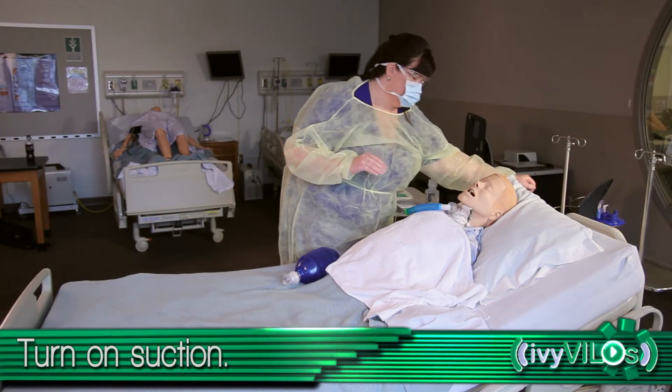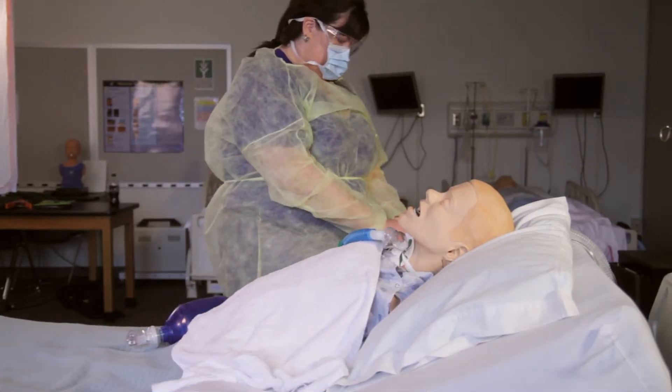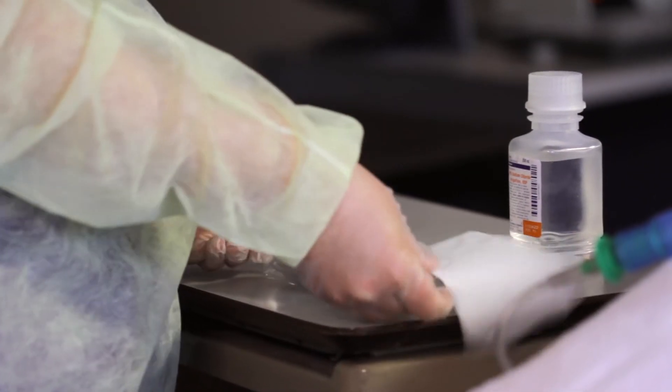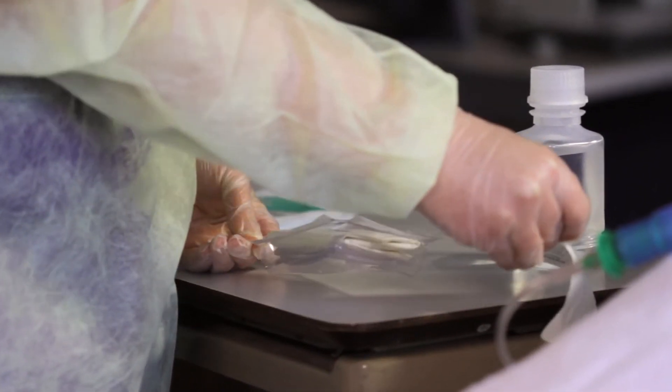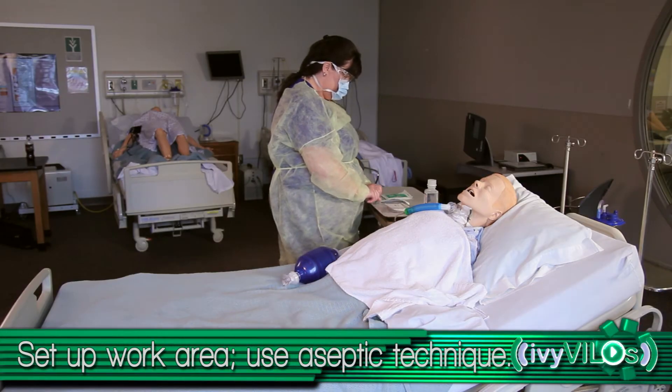Turn on suction. Open sterile suction package using aseptic technique. Open the wrapper away from you. Set up the work surface and pour saline into container if needed.